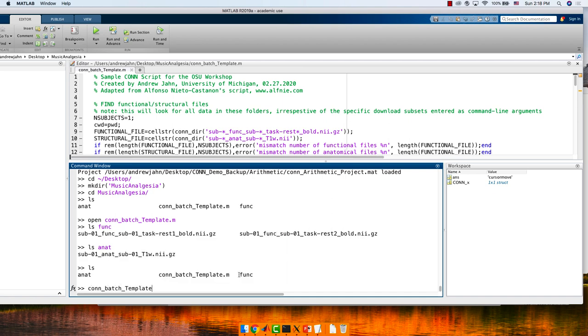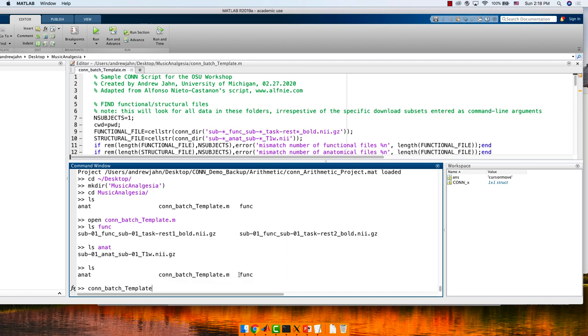If I type that, will it do the preprocessing? Regardless of what our eventual analysis is going to be, the preprocessing step is going to be the same for all of them.